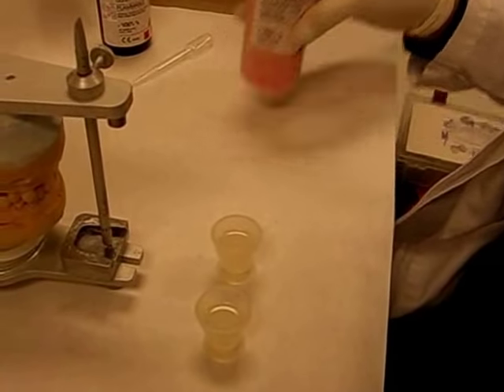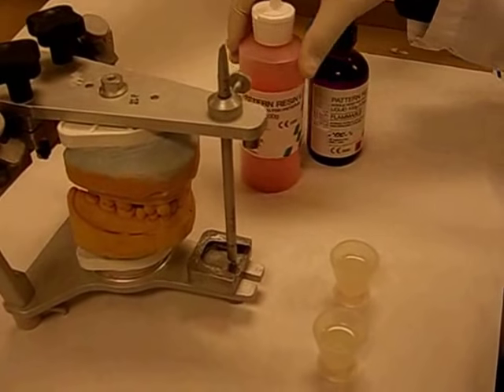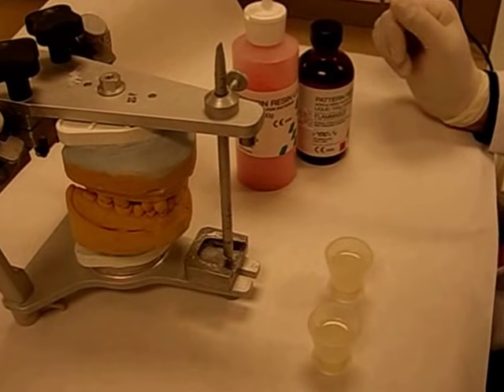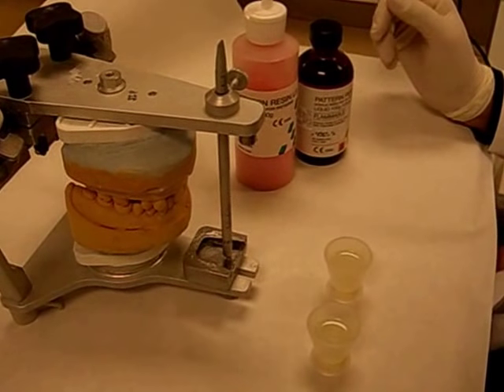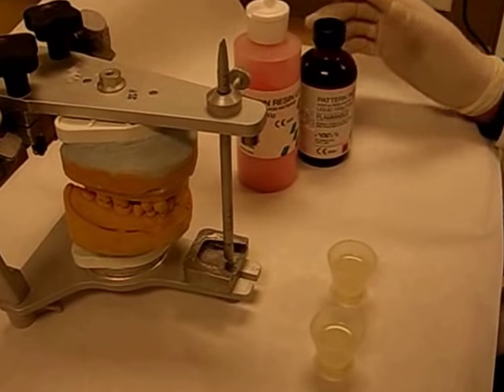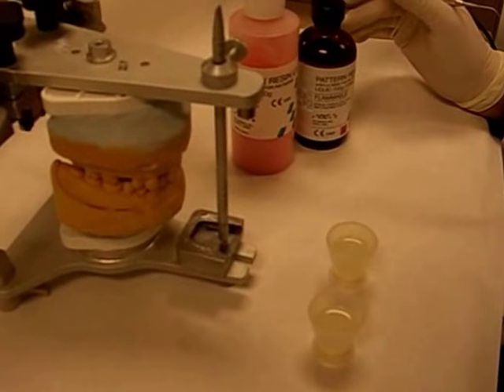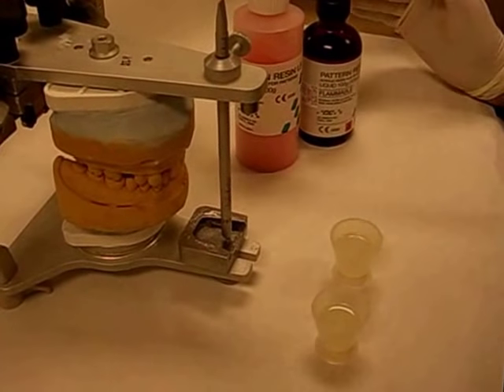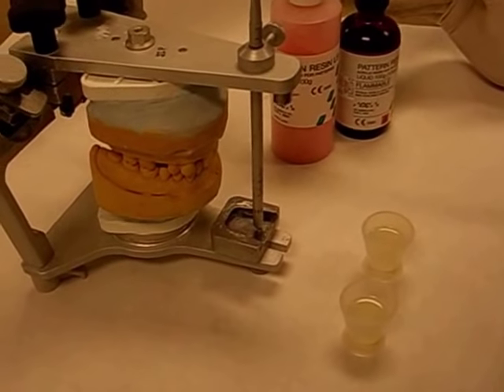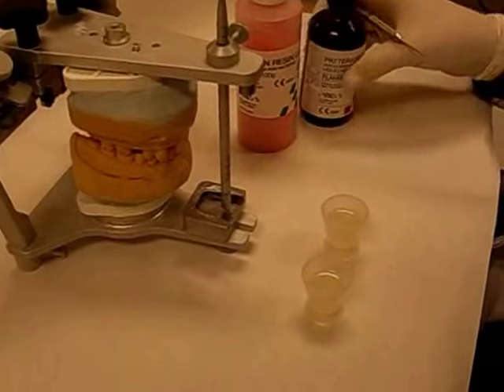I'm using GC Pattern Resin. This is a type of acrylic that shows less expansion than regular acrylic and it's also fast setting. It takes about 30 seconds to set — usually it's 12 to 15 seconds — but depending on the area where you are, if you have a higher temperature it will set faster. With the air conditioner, it might take about 30 seconds to set.